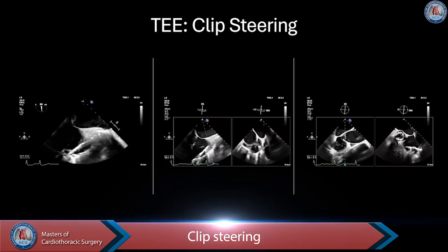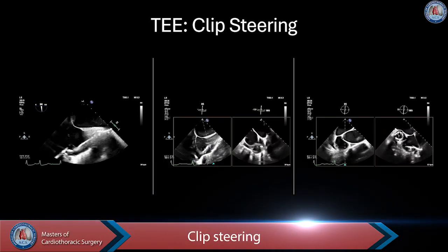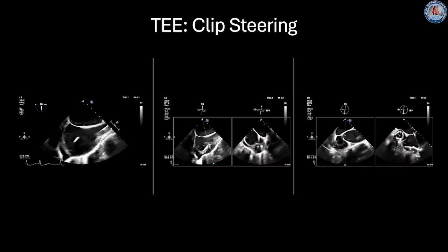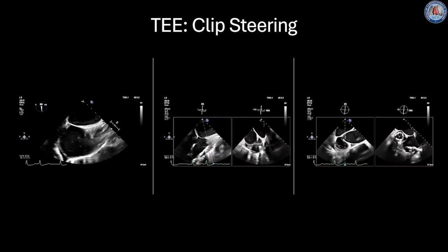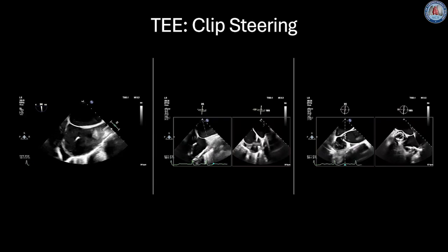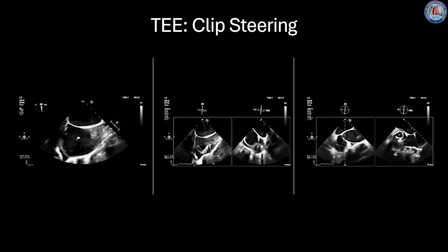On the left, a sweep demonstrated the ICE catheter and the steerable guide sheath within the RA extending toward the superior vena cava. Next, the TriClip was advanced into the RA, and under TEE guidance, the system was flexed inferiorly toward the tricuspid valve, with the final frame demonstrating appropriate trajectory toward the valvular plane.